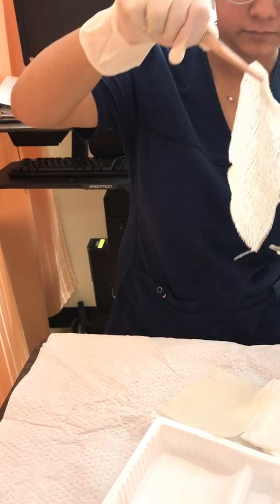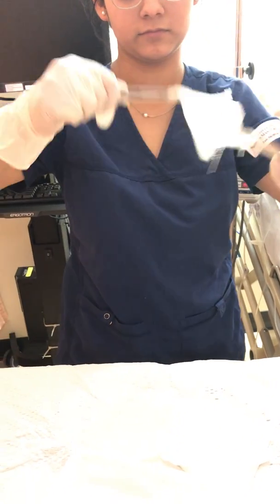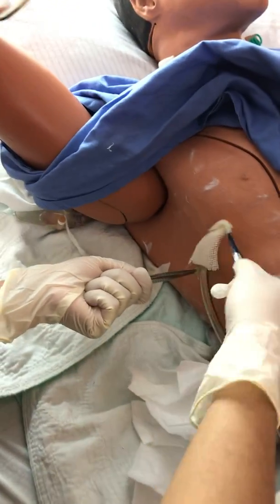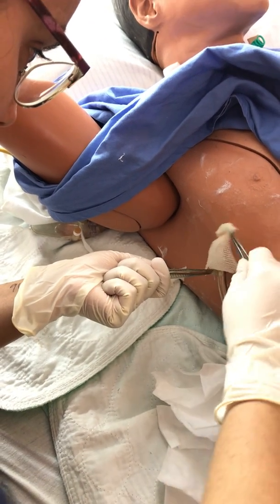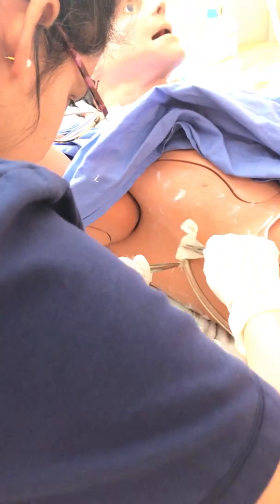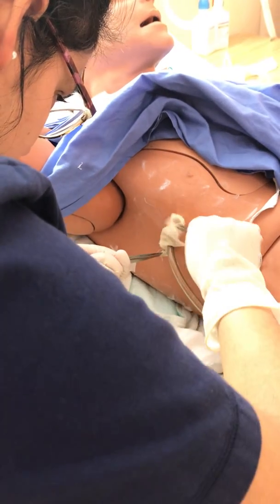So I'm going to make sure this is correctly transcribed. So what sizing, it is 1, 2, 3, 4, 5, 6, 7, 8, 9. 1, 2, 3, 4, 5, 6, 7, 8, 9. No known allergies. Right drug, fentanyl, right dosage, 10 micrograms. Right lockout interval, 5 minutes. Right route is IV, right time, and the time is now.